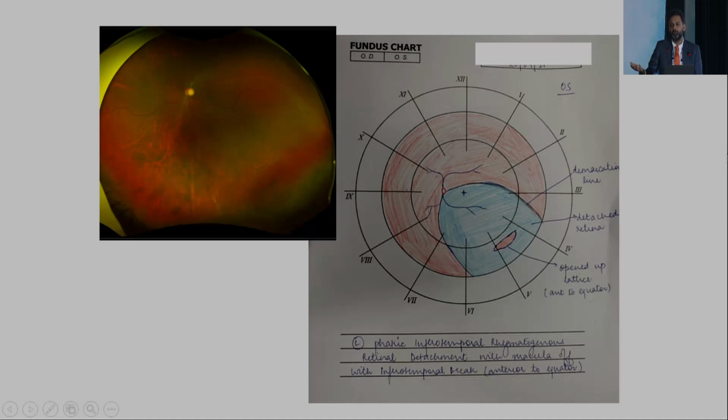And that is a representation, your Amsler-Dubois cartogram. That white thing is just to de-identify the patient. The idea is that anytime you want to reproduce something at any forum, please try and de-identify the patient and not have patient names, age, sex, and other demographic details. So, I think all of you know detached retina is light blue. The outline of the retinal break is a darker shade. The retinal break per se is red, and that will tell you what is going on and what is not. So no PVR apparent, no choroidal detachment, and single break.